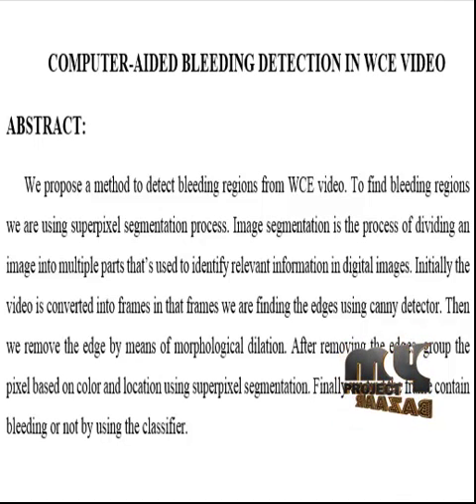The canny edge detection is an edge detection operator which uses a multi-stage algorithm to detect a wide range of edges in the images. Initially, Gaussian blur is applied to the images in order to eliminate unwanted edge information. Then gradient operators are employed to find the gradient intensity and the directions. Non-maximum suppression determines if the pixel is a better candidate for an edge than its neighbors.